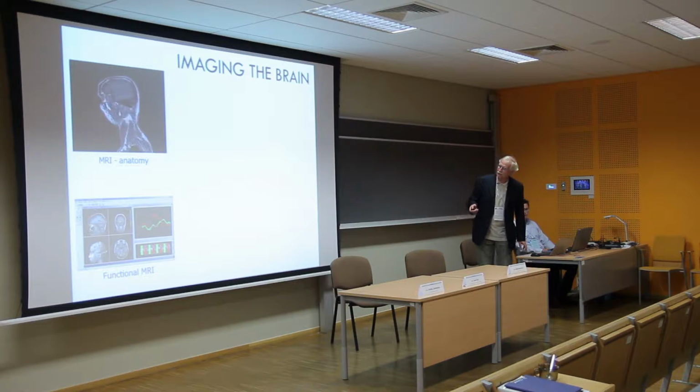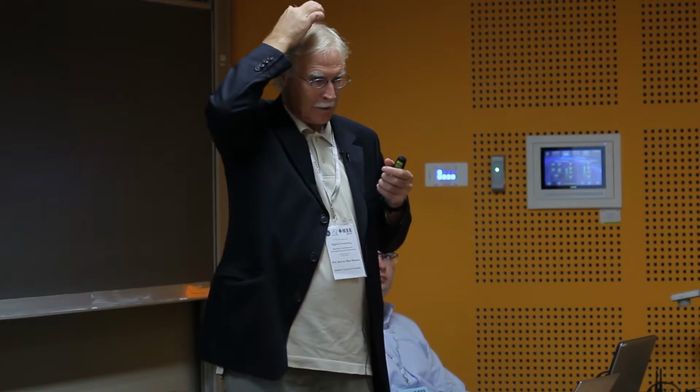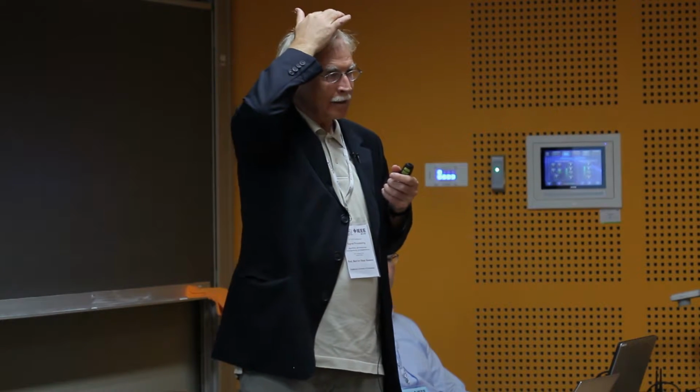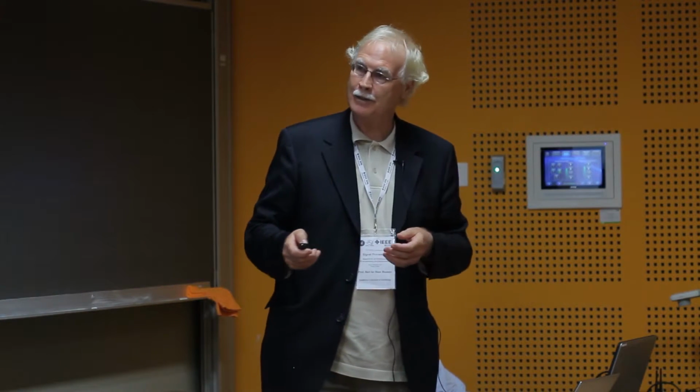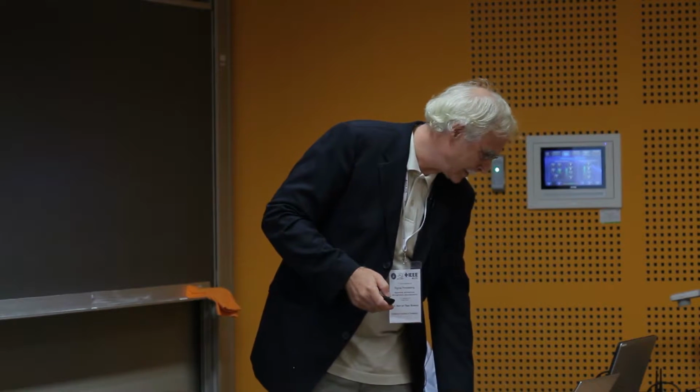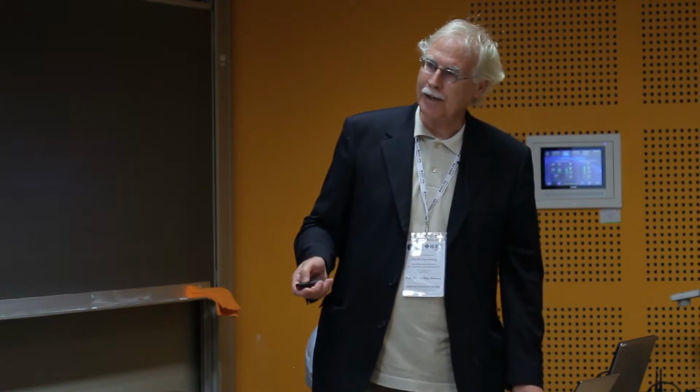This is another MRI technique. If you use part of your brain, suppose I use my hand, then I use this motor strip. Here is all my muscles here, and somewhere here is my hand. So this is active. These neurons, they give action potentials. They need oxygen, so they give a signal to the blood vessels, please bring more blood, open. And blood has oxygen, and oxygen is paramagnetic, and you can see it with an MRI scan. So you can actually see active areas with MRI.